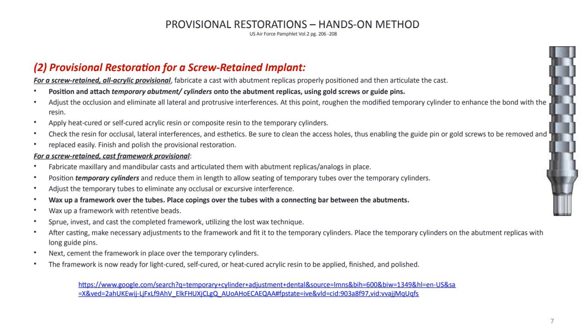And it's recommended, especially on the lingual side where it's not very visible, that the connections be big, so as to fill up the space between the teeth.